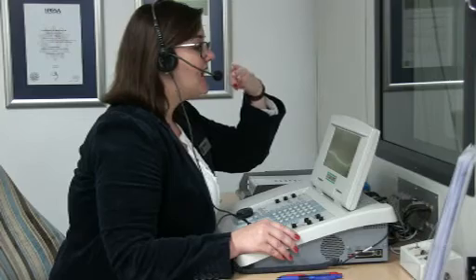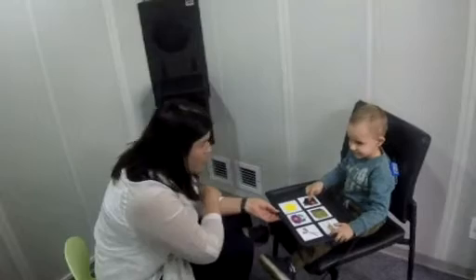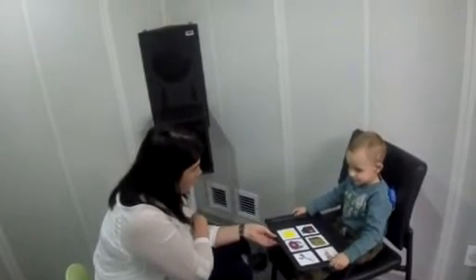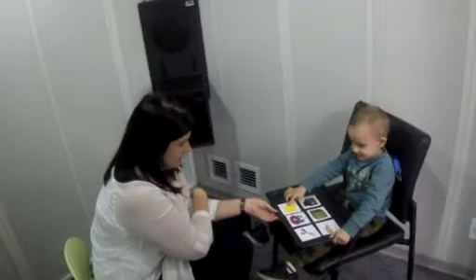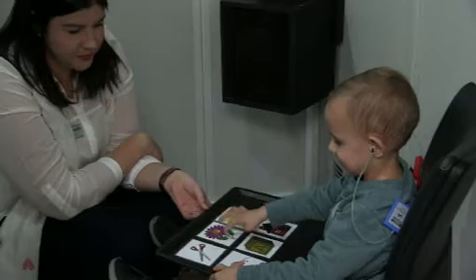The testing audiologist can now proceed with the carrier phrase, "Show me the" for all minimal pairs. Wys my die huis. Wys my die muis. Wys my die skêr. Wys my die blom. Wys my die ster. Wys my die blok. Repeat the test for both ears.